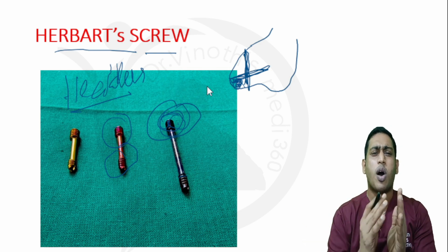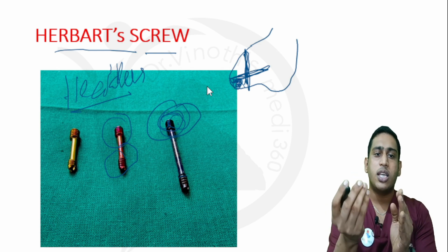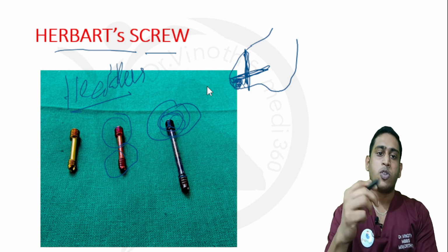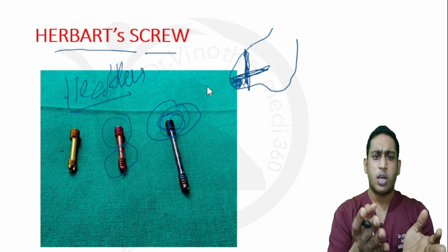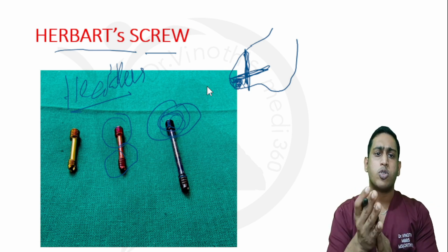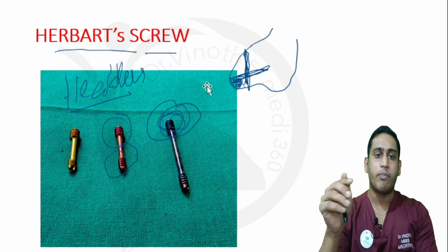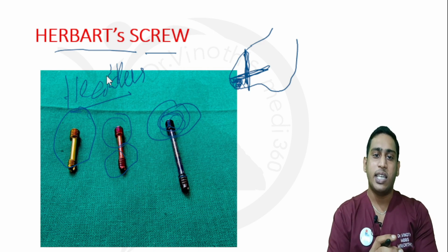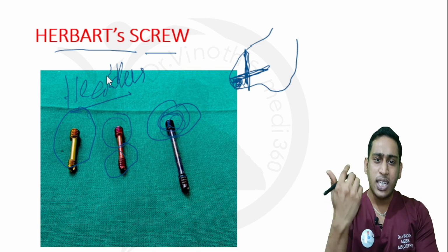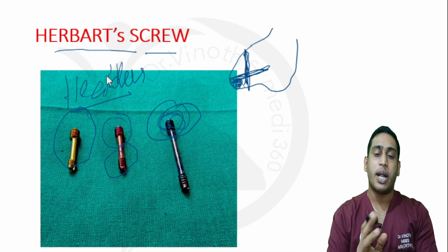For small fractures like a carpal bone fracture, scaphoid fracture, or lunate fracture, these screws are available in small lengths also, so they can be used for small bone fractures. And one more thing, you will be having a doubt: sir, we need to remove the screws after some time, so how is it possible if we bury it very deep? These screws are made of titanium, so you need not plan for any removal. They are even magnetically inert, so with this screw a patient can take an MRI also if required.